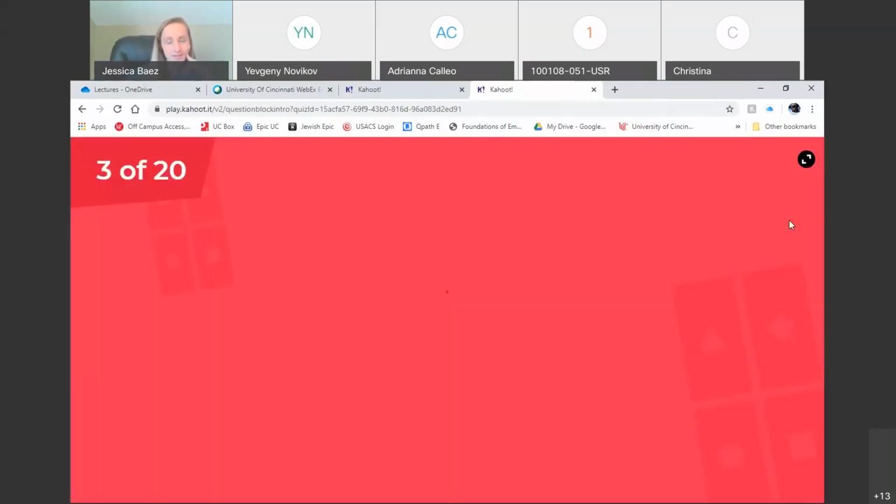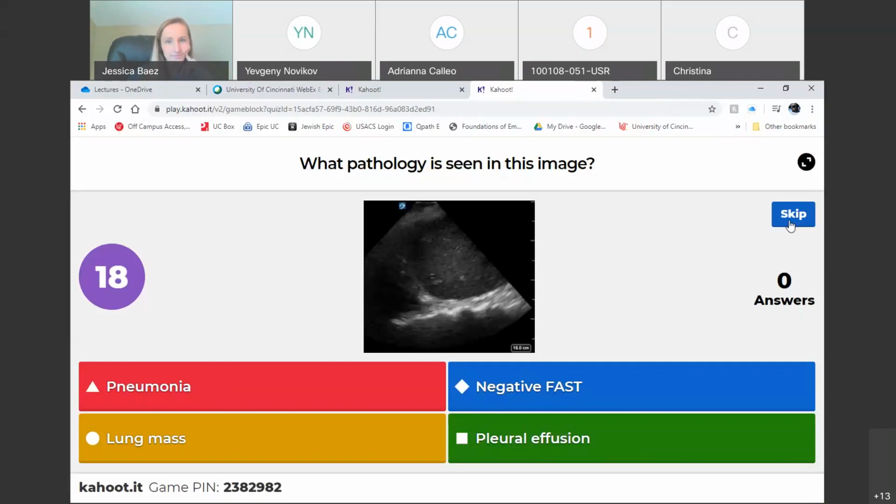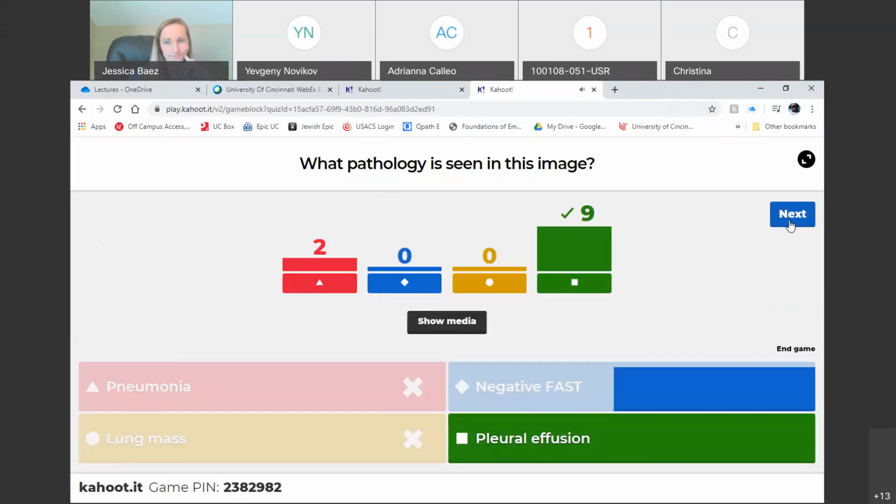All right, next question. All right, so that picture had a spine sign in it.